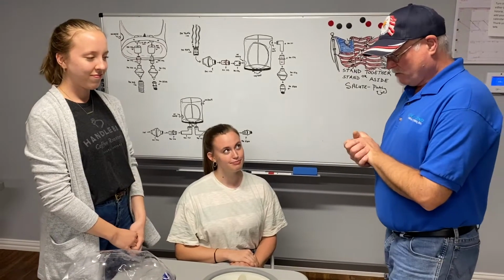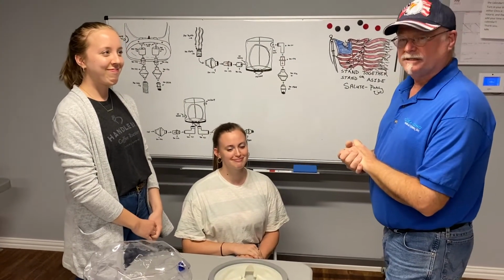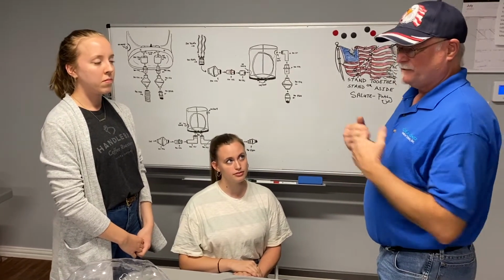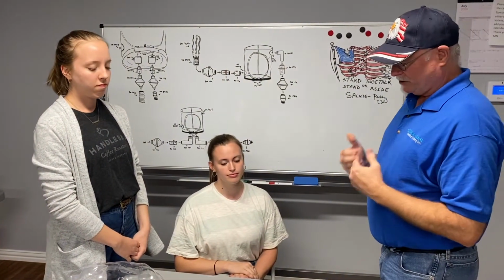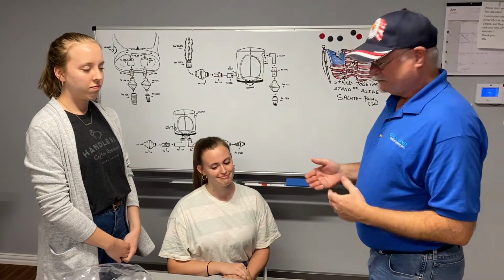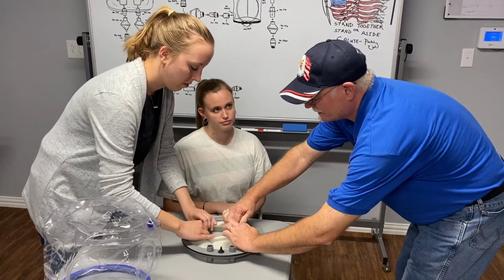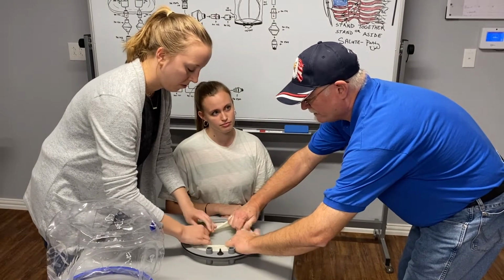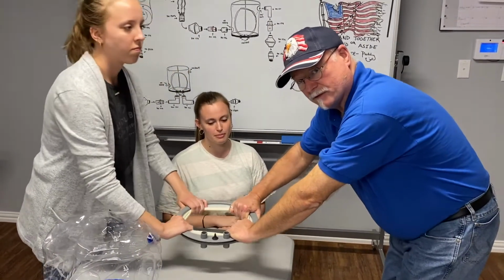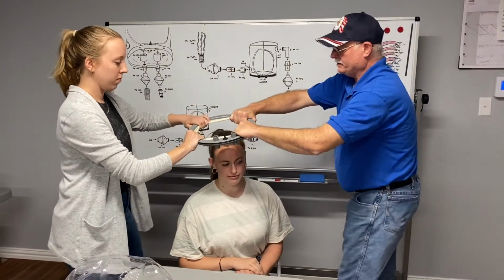All right, now we're ready to put the neck seal on. I have a wonderful assistant here, and we always recommend, if at all possible, having two people put this on. It ensures that you won't tear the neck seal, and it's much more comfortable for the patient. Each one of us will grab it, and you're actually rolling it. It's hard to tell, but we're rolling this into like a Tootsie Roll. Then you pull it out, and that roll helps make sure that you're not going to tear the neck seal. Plus you have a nice wide smooth opening to go over the head.